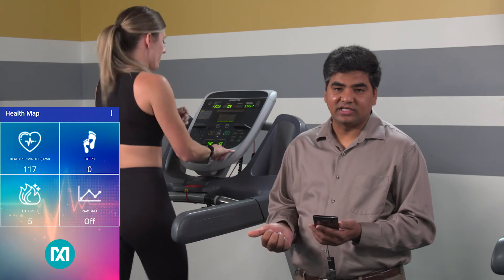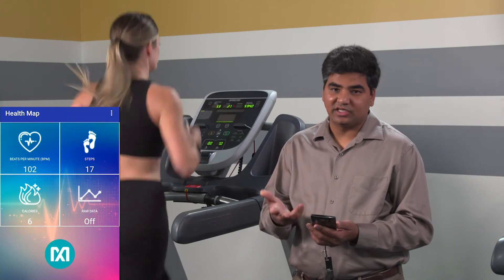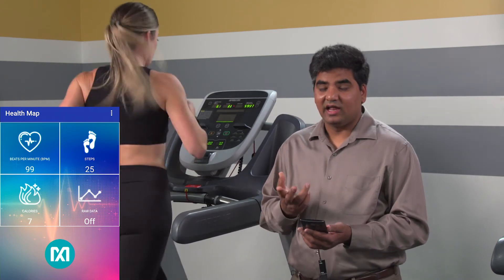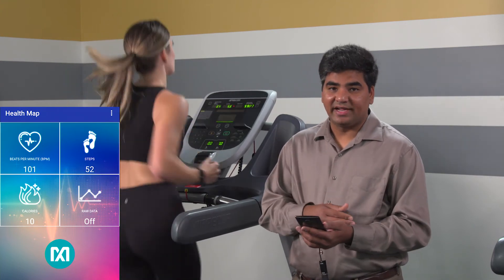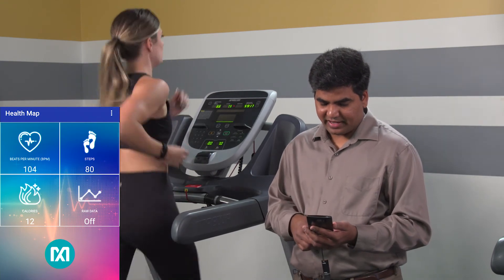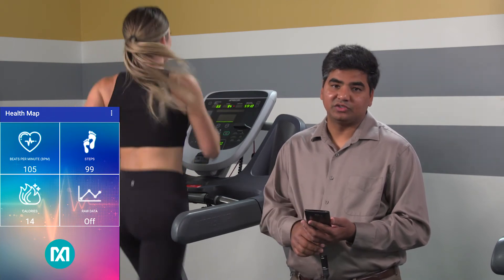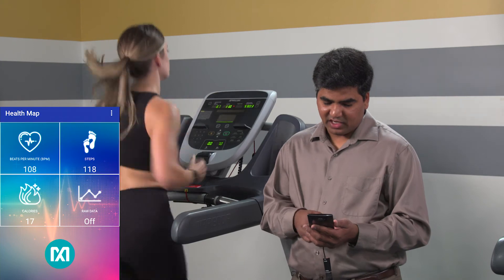As she's running, we can also see her step counts going up and her calorie consumption going up. This Healthband, as I was explaining before, can track your heart rate, step counts, activity classification, and energy consumption. An important thing to note: as you saw Alison wearing the watch, it has to be snugly fit so the optics have very good contact to the skin, giving you better heart rate accuracy, especially during motion. You can see the step counts being counted in real time, along with the calorie consumption. The heart rate will take a little longer because there is an averaging feature built into it.